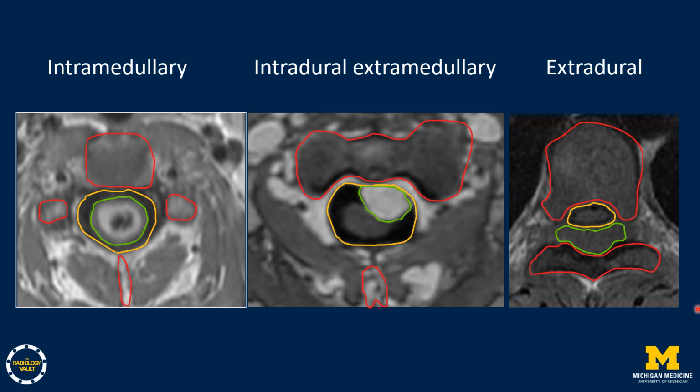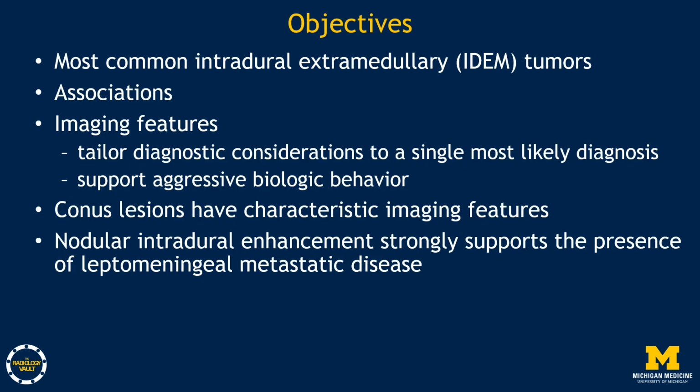Understanding the lesion location relative to the spinal cord and meninges is crucial for narrowing the differential diagnosis and guiding management. Let's begin by reviewing the objectives for today's session.